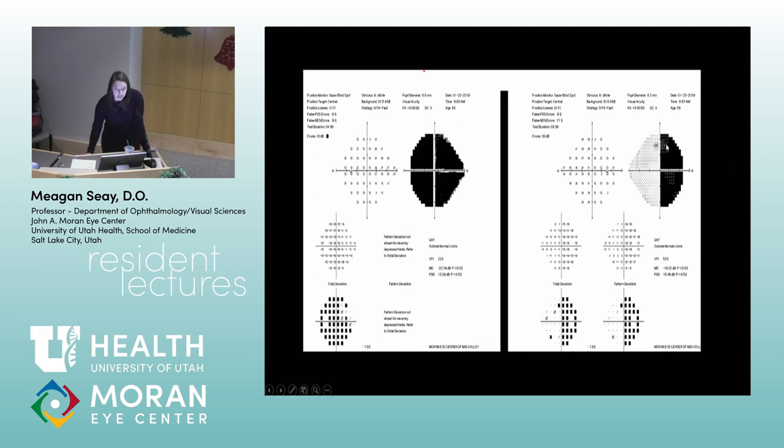So you know it's at the chiasm or behind because you're getting this vertical meridian respecting temporal defect in the right eye, but you're getting this diffuse depression of the left eye. So that's more anterior to the chiasm. So as a definition of junctional scotoma, it's at the junction of the optic nerve and the chiasm, affecting, in this case, more of the left optic nerve, but catching those fibers in the chiasm that gives you the temporal defect in the right eye.